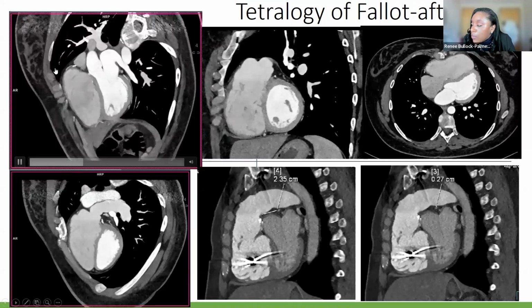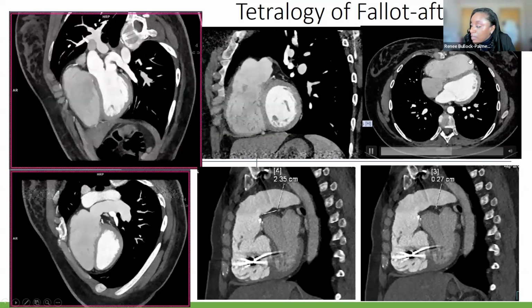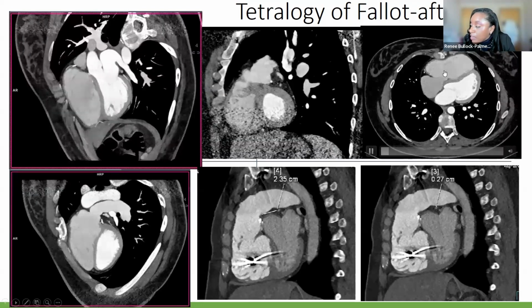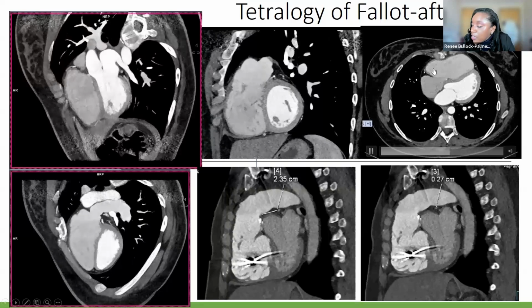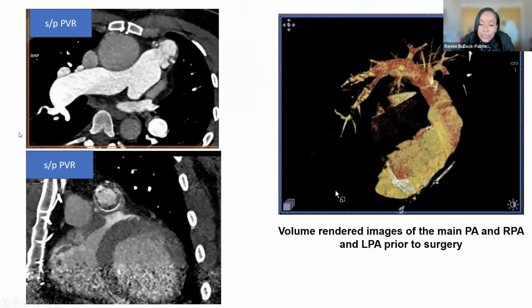The right ventricle, although the function is relatively preserved, you can see that there's that apical ballooning there, so it's not quite normal. The LV is slipper shaped because you have that very flattened septal wall bulging from right to left, indicating that that patient has significant volume overload of the right ventricle.